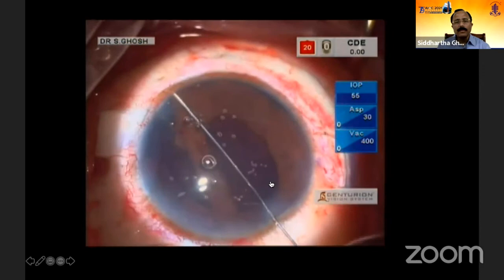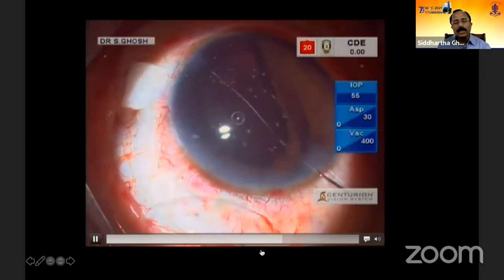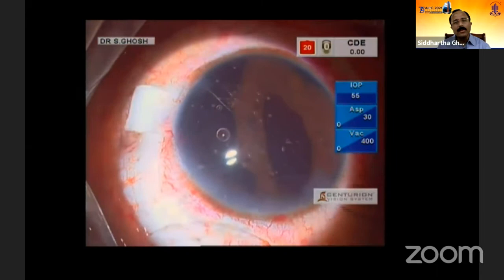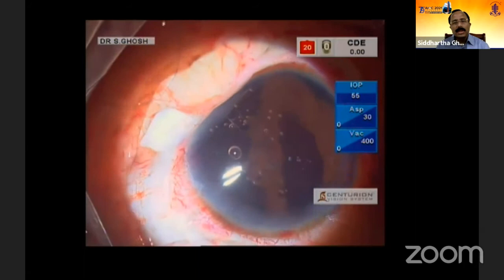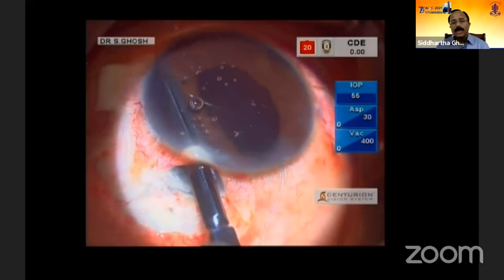And the simplest one was to use a slip knot, which would actually pass to the interior inside, and then we need to cut the knot ends from inside the eye. So that is how it was easily done and very effectively done. So we can use a micro scissor, or okay, if my time is up, I'll just show that we cut the loose ends, and that is how we complete the case here.